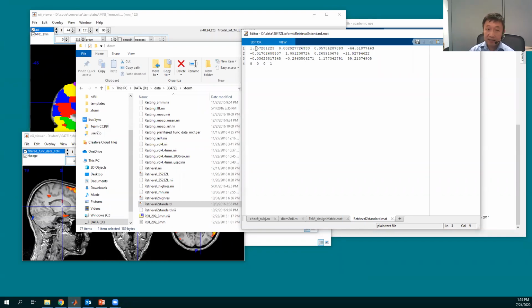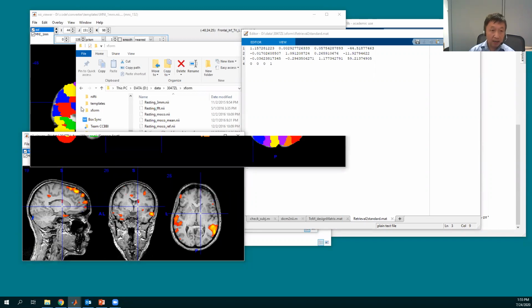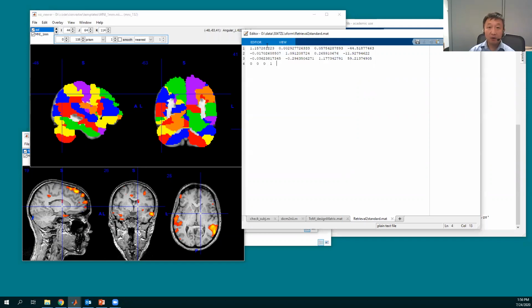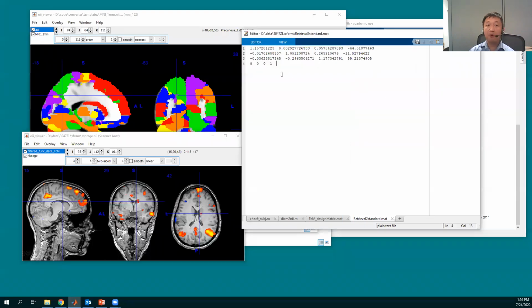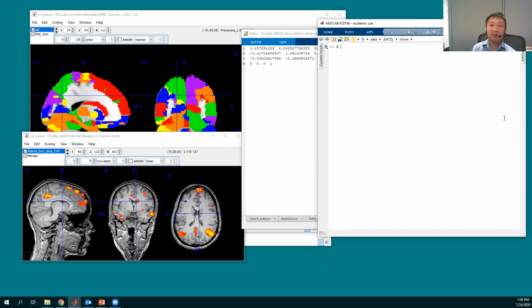So in this case, it's not exactly 1, because when we align this brain to the standard brain, there's a resizing part because the brain size doesn't match. So a little bit, like 15%, 10%, 17%. That's from this guy to this guy. But here we want to transform this guy into the other, so that's the opposite. In Matlab, it's so easy.